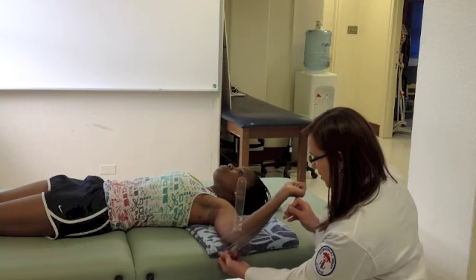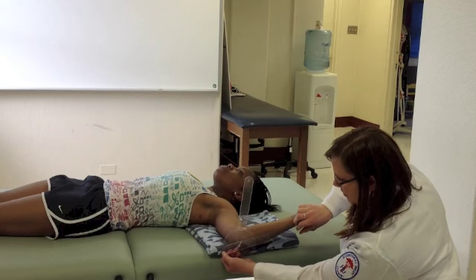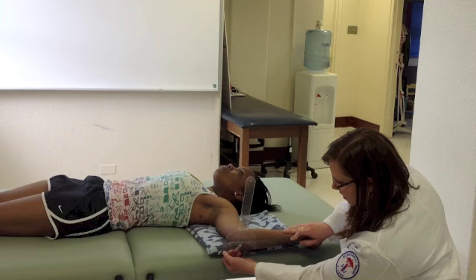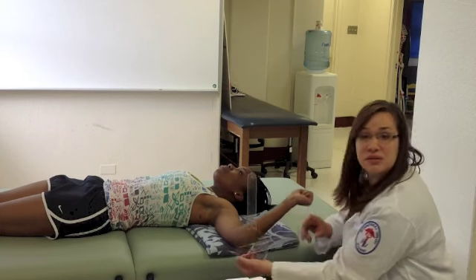So I'll measure first the active range of motion to about 73, and then I'm going to move you a little bit more. Tell me if it hurts. And then here we've got it about 85 degrees. So that's about at full range of motion.